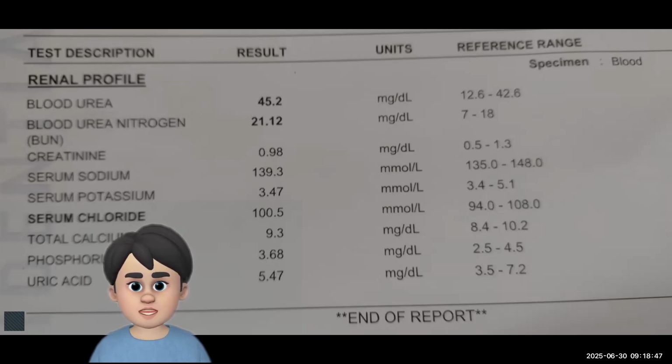This comes under clinical biochemistry. Every physician and surgeon should know how to interpret these things. Now these are also interpreted by specially trained physicians, whom we call clinical biochemists or chemical pathologists. In Sri Lanka now you get chemical pathologists and clinical biochemists. If the physician or surgeon has a problem regarding this blood report, we refer and get an expert opinion, because chemical pathologists are the experts.